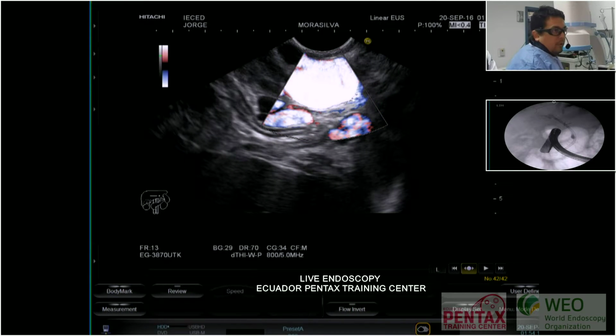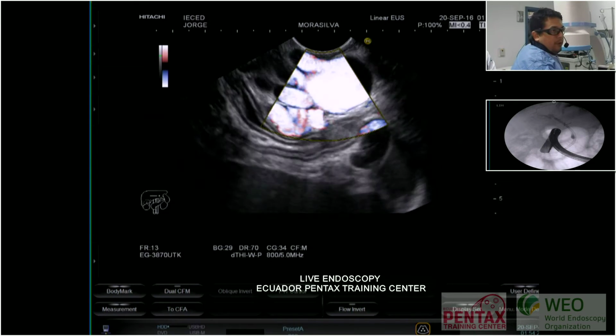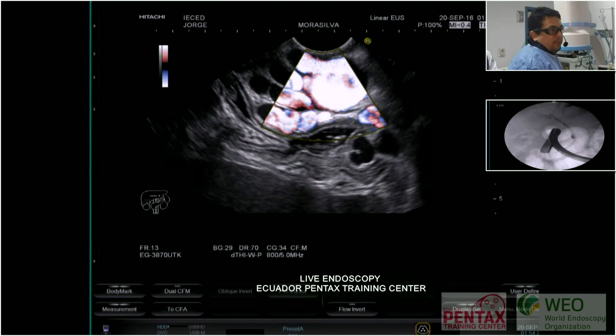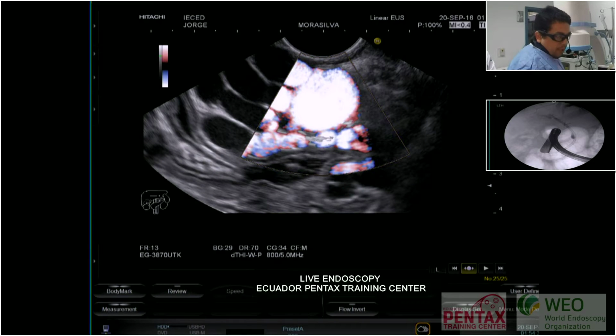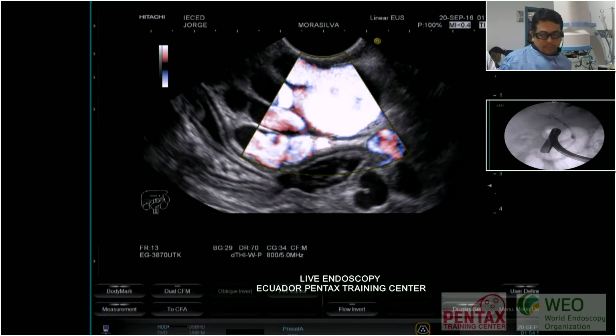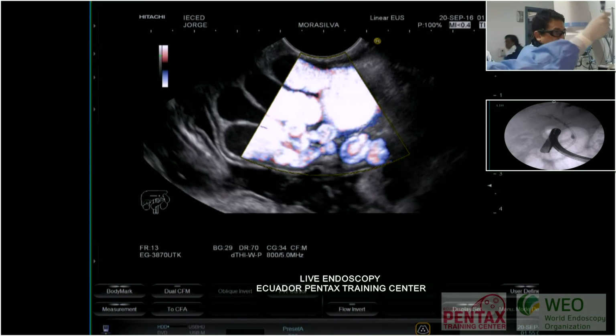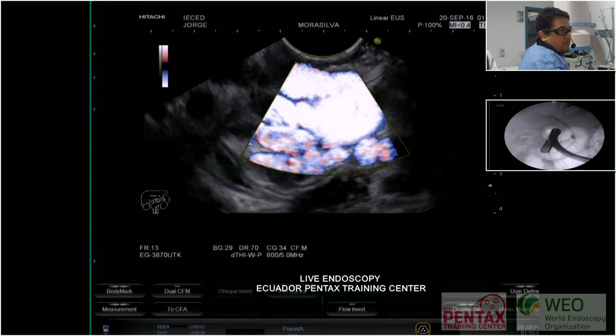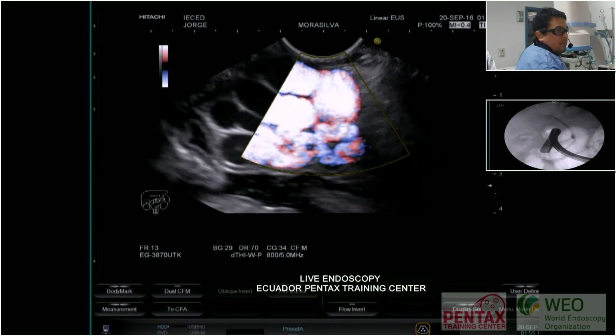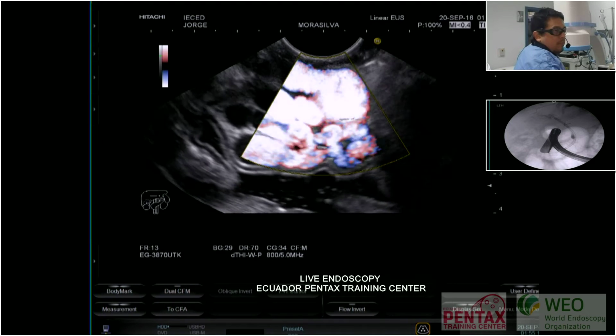Okay, so I will use a 19 gauge needle from Boston Scientific. The standard needle is okay to perform this procedure. Here we need to recognize the anatomical aspect. Here you have the esophageal wall, and here you have the stomach wall. We will pass between the esophageal wall and the stomach wall to arrive to this area. Dame la aguja. We will block our US.